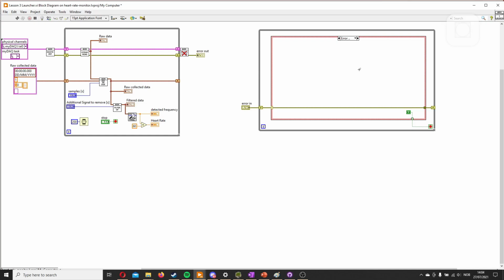So with our application, it is so simple, there's really nothing that can be harmed. But say you were running a heating element or something, and rather than stopping the application when it's overheating, it just continues heating or something similar like this. By finishing and stopping the application into a safe mode when you're done, rather than just pushing through the errors, will reduce the amount of harm you can do. Again, this is not anything that we have to worry about for our application, but it's good practice. So it's better just to do it on every project that's larger than a few VIs. We will need 2 of this loop. We'll need one for this part and one for the acquisition part.